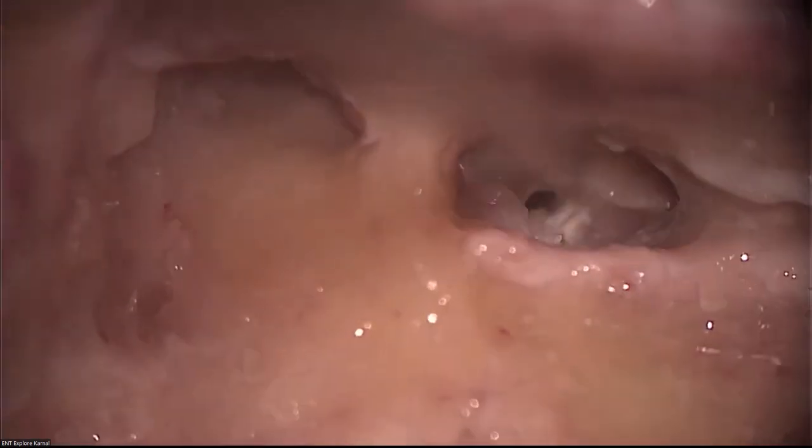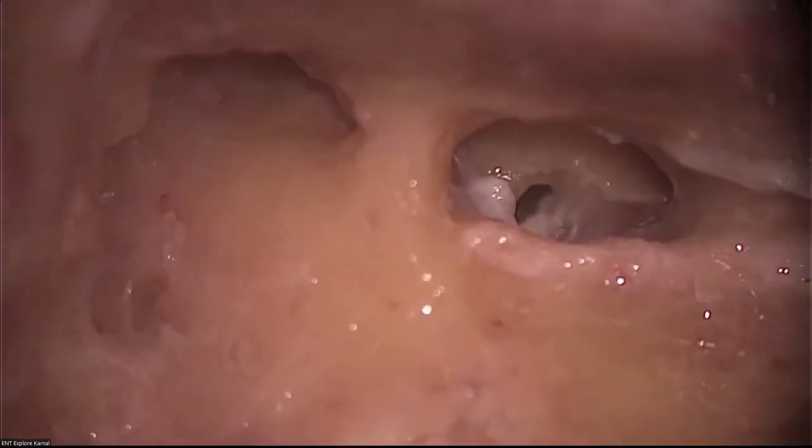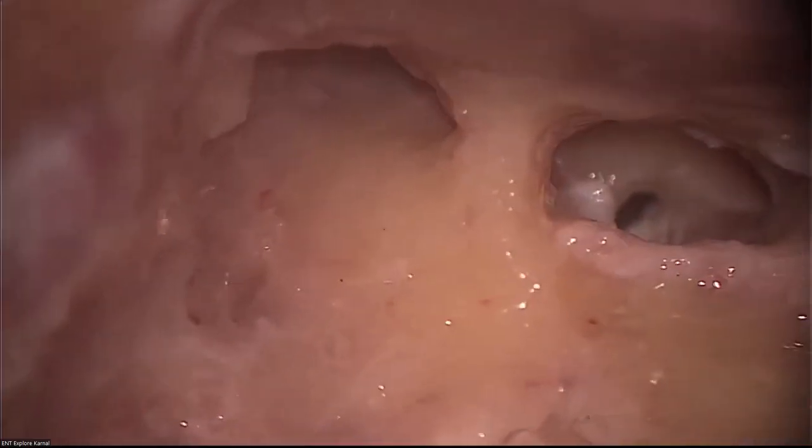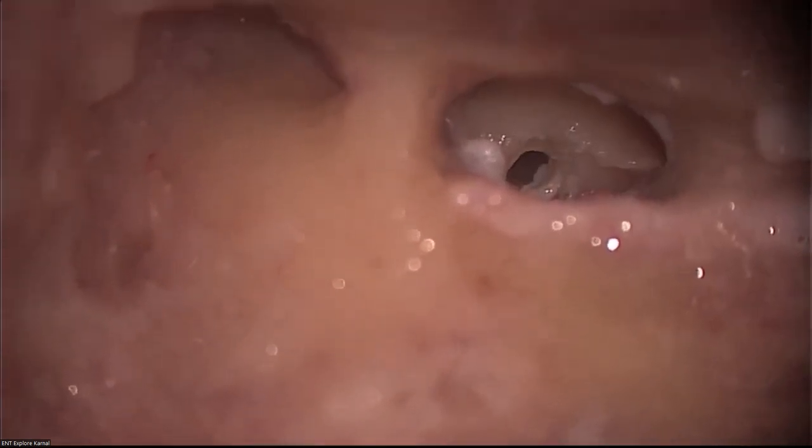This is the crista. So this outer lip is the crista. You can remove the crista safely and then your implant will have a straight axis. The crista is very, very safe to remove. Do you remove the crista in every case, even when you are using slim electrodes? Whatever. See, the reason is I want my electrode to stay in the scala tympani.